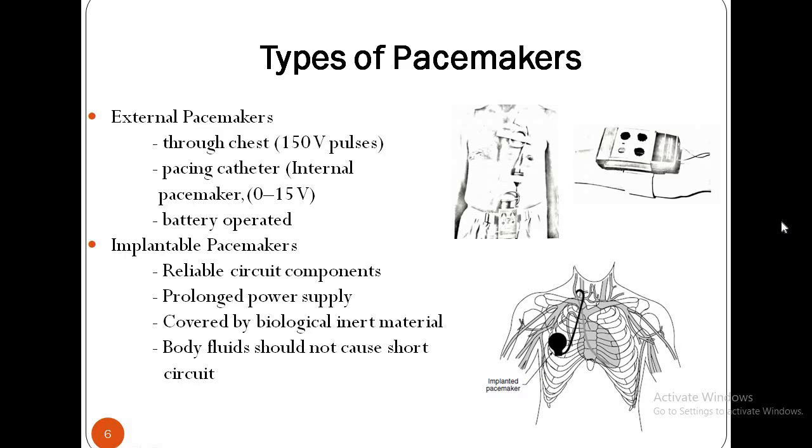The external pacemaker is the one that has the power source outside the body. The pulse generators are usually battery powered. They can be worn in the pocket or strapped to a limb or to the torso. They are designed to function in the asynchronous and synchronous modes. Some units also operate in a synchronous triggered mode.